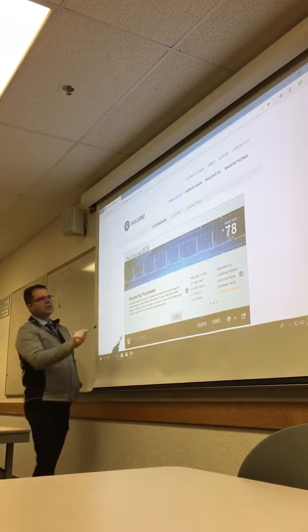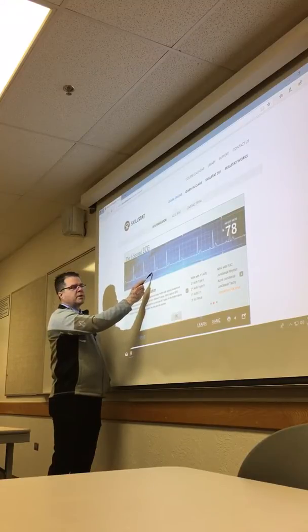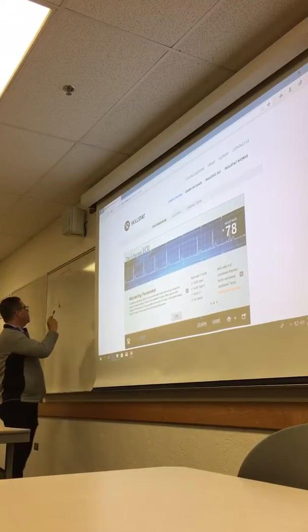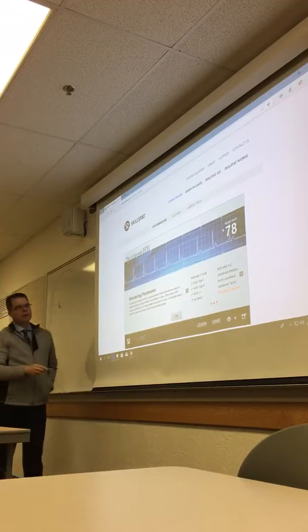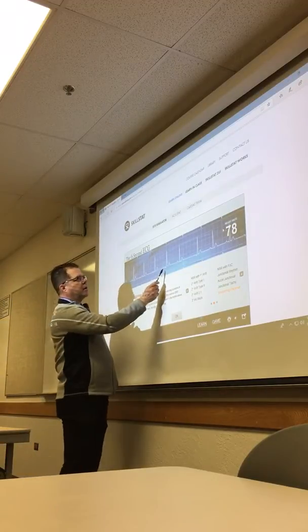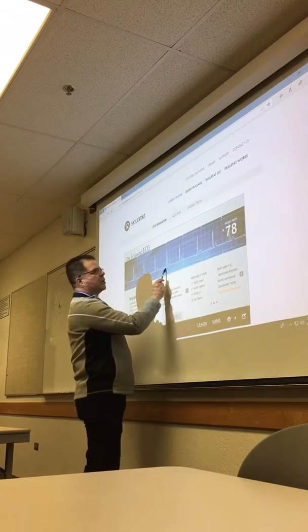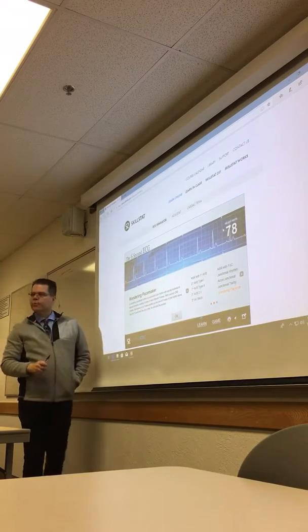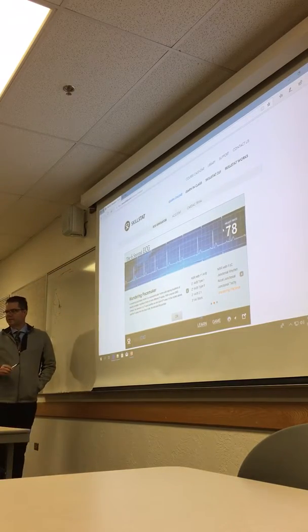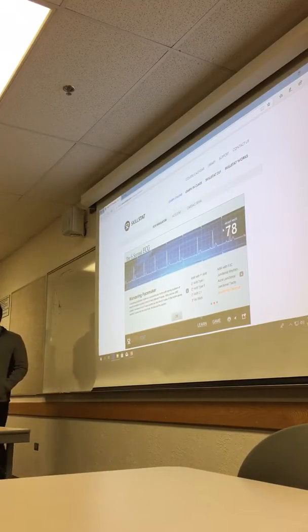But when one of these looks different, like this one, it's coming from a different area of the atrium. And I think we have one more, and this one. So I have 1, 2, 3. That one looks like this, and then we start all over again. So I have 3 pacemakers for this rhythm. One may be the SA node, and the other 2 are coming from other areas of the heart.